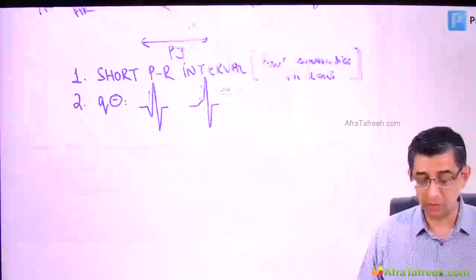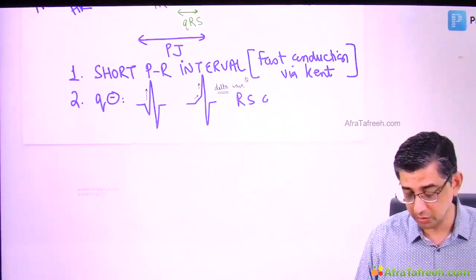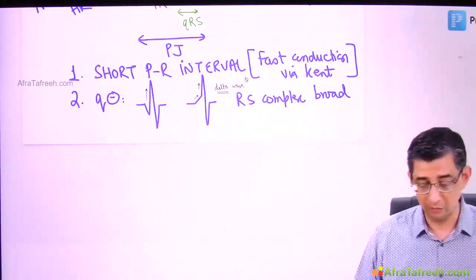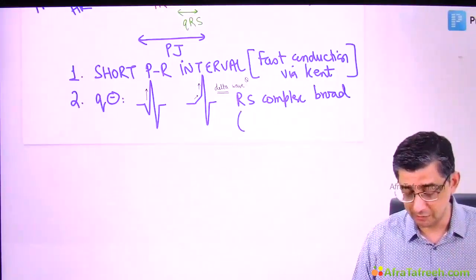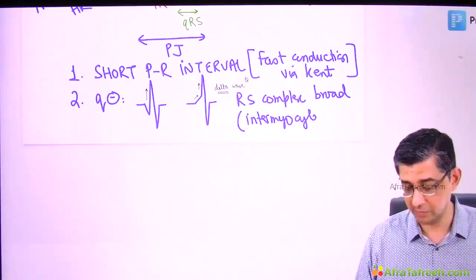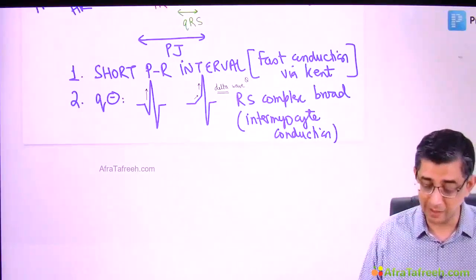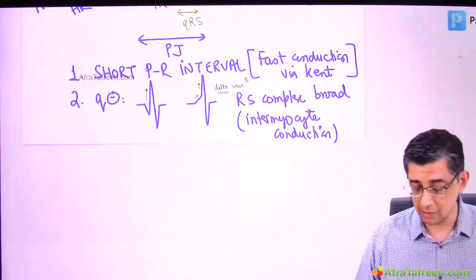So when I focus on the aspects related to the ECG of this person, I have highlighted before you that the RS complex, I'm calling it RS because there is no Q, will be relatively broader. Now, why is it broad? One, this change in the slope will contribute to slight broadness. The second reason for the broadness here is intermyocyte conduction. Remember, I said the concept of physiology. Intermyocyte conduction is slower than any other conduction fiber in the heart, in a sense that Purkinje is the fastest one, so this has to be relatively slower. So when I say slower, it will be broad.